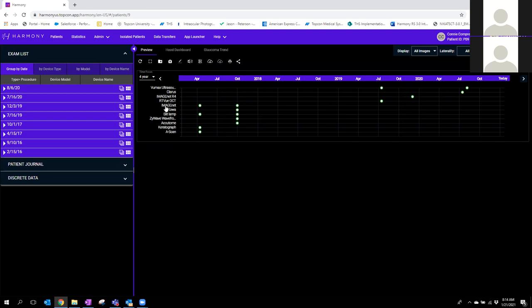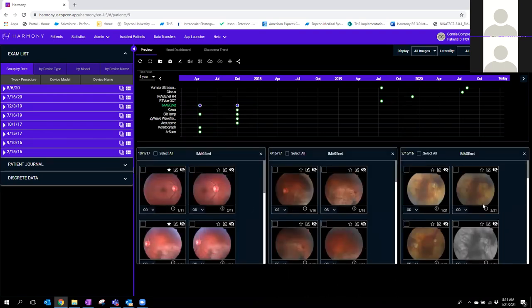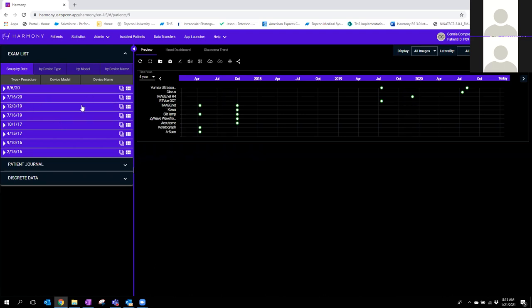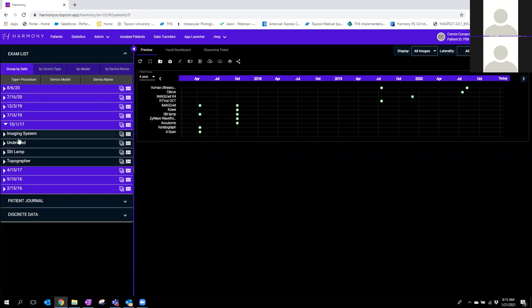You're probably going to work off the left side — that's a bit more conventional. This is customizable and largely looks like this based on how I set my user preferences, which we'll get into later. I have a default listed by date in descending order, putting the most recent date first. As you open up each date, you get a sub-list of exam types for that particular day. As you open it up the second time, you can see things like ImageNet, device model, device name. You can categorize your exam types and do a quick preview of what was performed on that day.